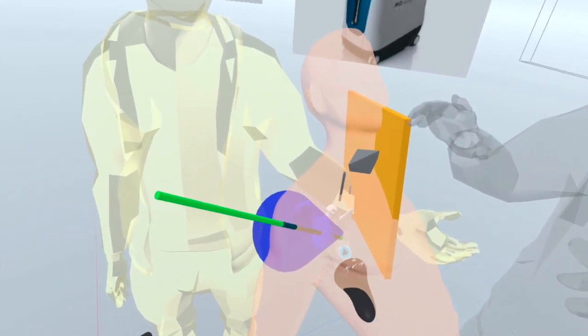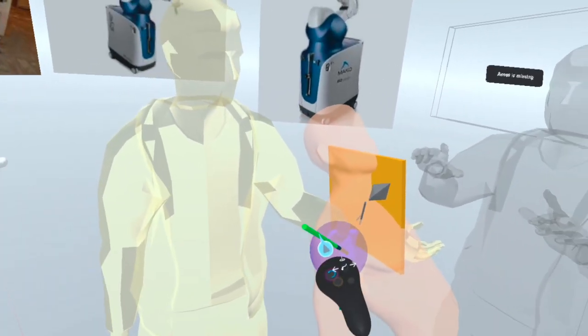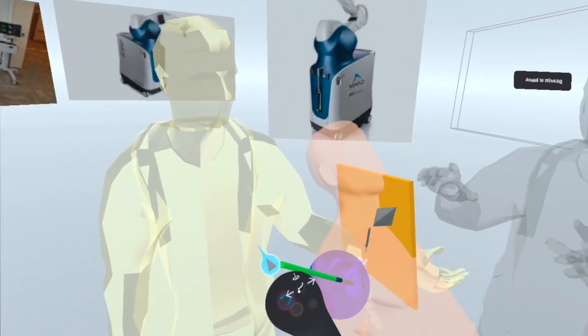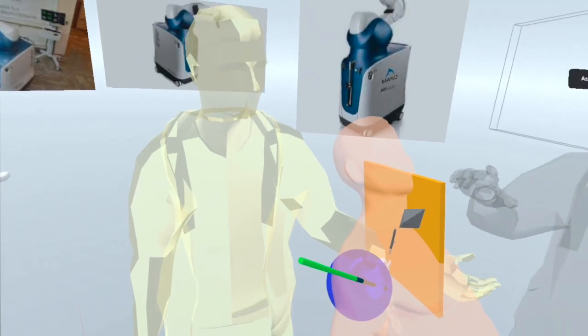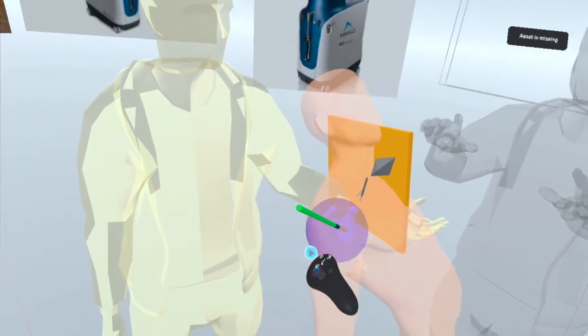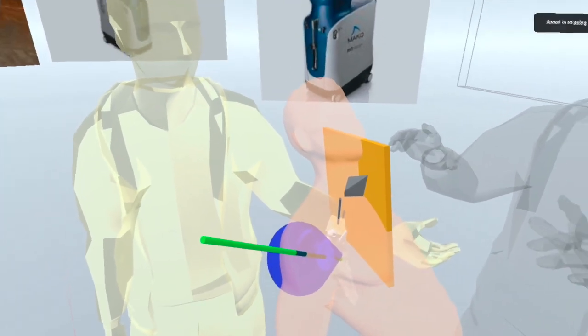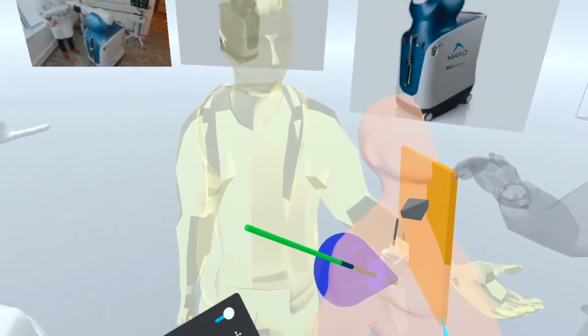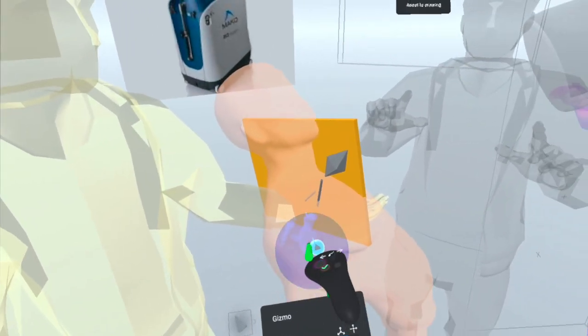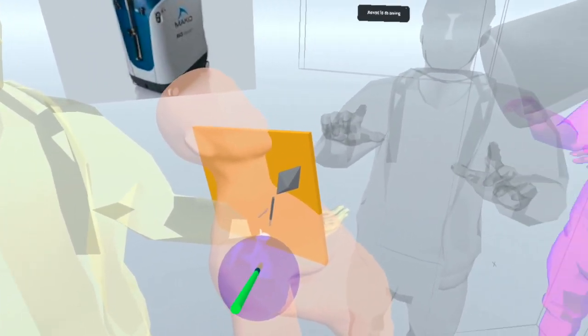Here we have some drapes to get in trouble. Here we have the scapula, and this is the axis for the scapula to perform a reverse total shoulder arthroplasty. We're going to drill like that, and this in blue is our approach, the area that we will be able to work with during a shoulder arthroplasty.